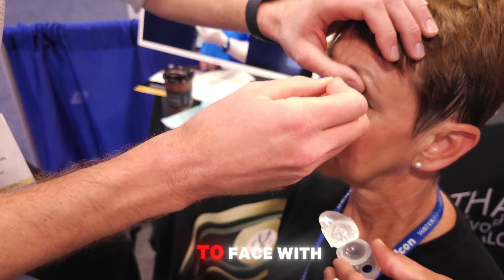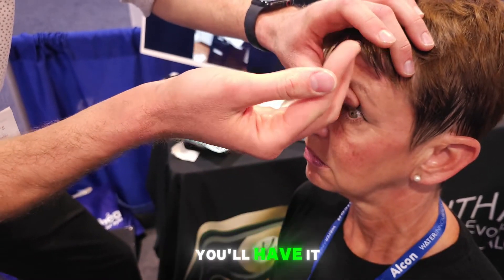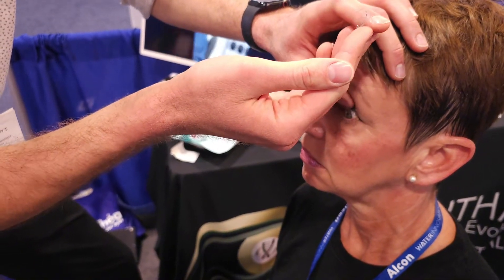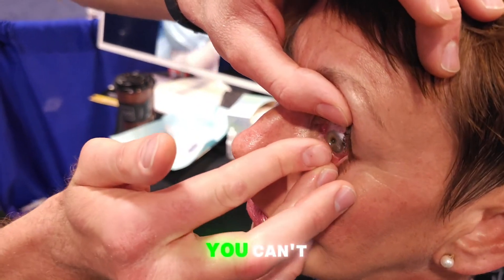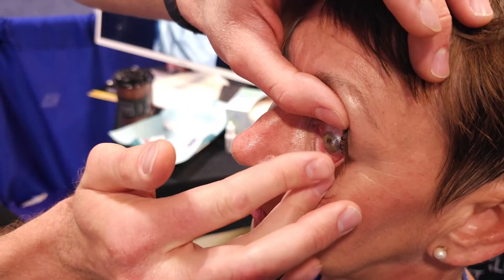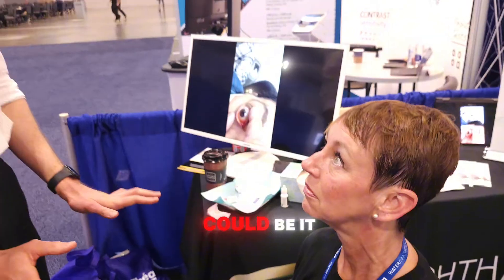Take the bandage lens in front of her. It's easiest if you're face-to-face to get it on the tip of your thumb and then go straight on — if you think of touching your thumb to her pupil, you'll have it.